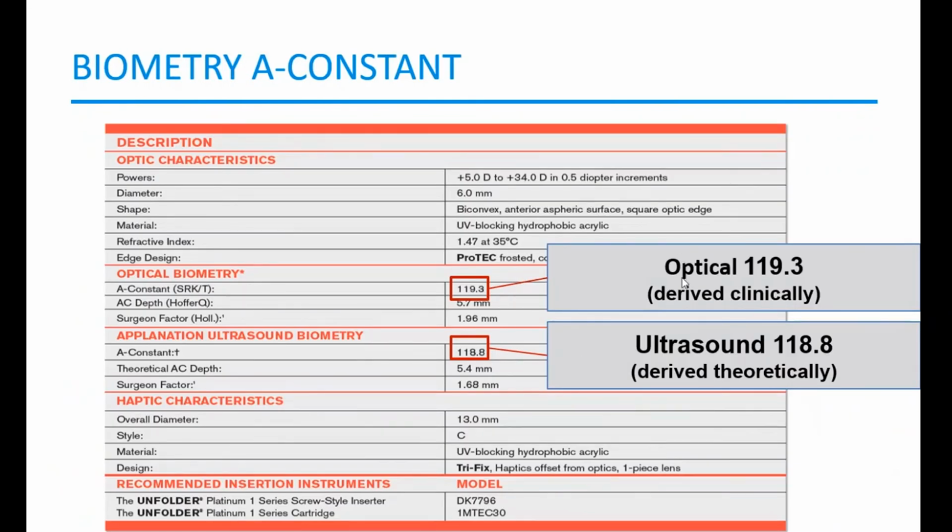Right, so like I said, choose the correct constant according to the axial length measurement method that's being used.